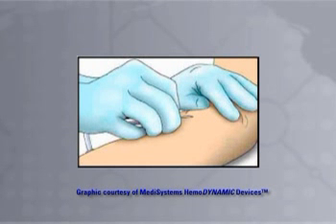Cannulating a fistula is the formal description of the process of inserting needles into the vascular access, and it is technically more challenging than cannulating a graft. Although you may sometimes hear the terms placing, sticking, or needling in common usage, we have chosen to use the more formal term cannulation throughout this program. I hope that you will find this program helpful in the care of your patients.